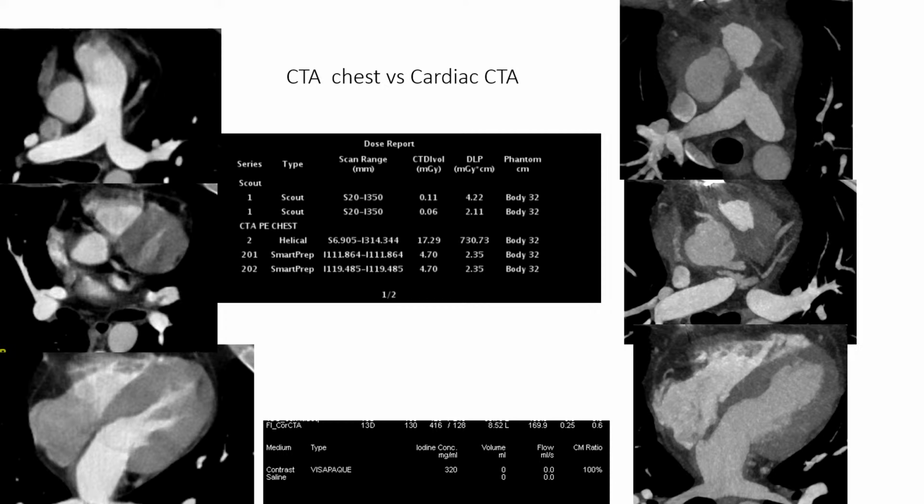Essentially, we're imaging the same structure. You can tell the day and night difference, because this is a mixture of different parts of the cardiac cycle. So you get all this. And there's always an issue when the patient gets a PE rule out. But we can do this. The only thing they have to do is put on an EKG and acquire gated, so you can do the triple rule out that we do routinely here with one single scan.